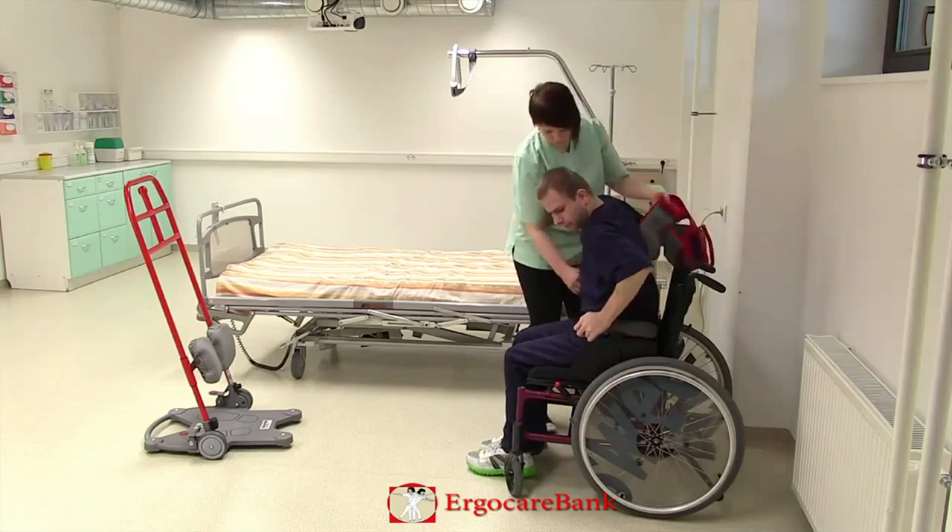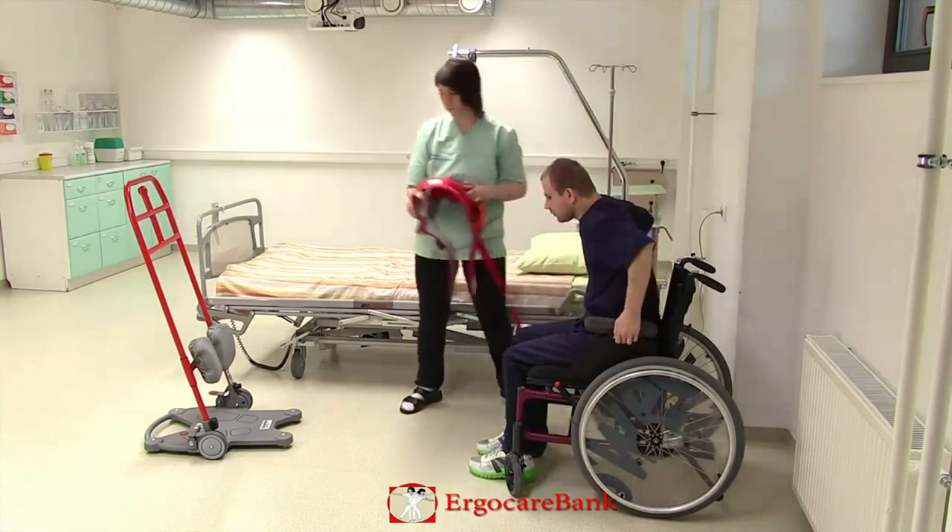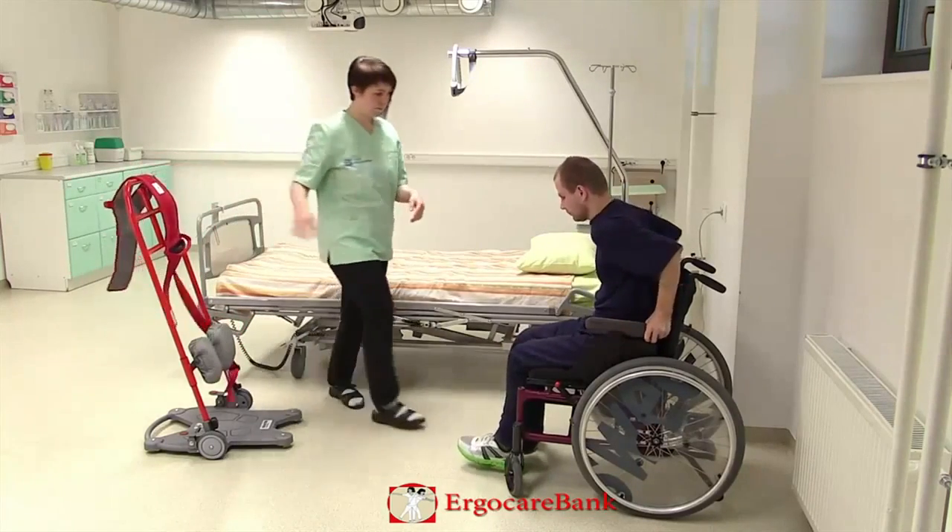She puts the foot plates back on and Charlie lifts his feet on. He lets us know that he's sitting up at the front and is ready to go.